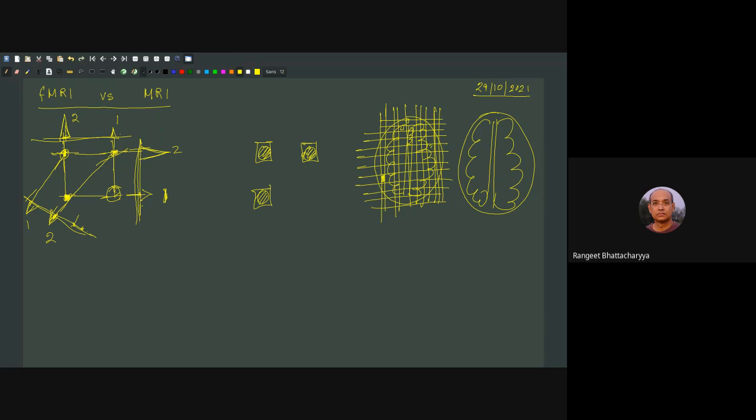So I will simply leave it at that: projection reconstruction remains one of the earliest techniques. Very early on, that is how we used to do it. And later, people found out much more robust methods. In a couple of minutes, we can record a spectrum where multiple projections are recorded at the same time. That's the advancement we made. So that is MRI.